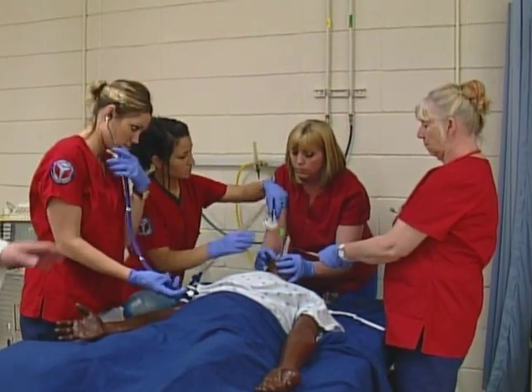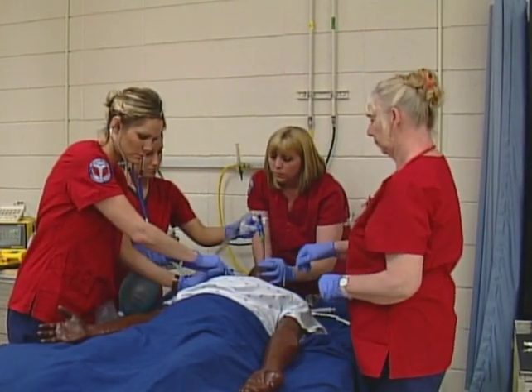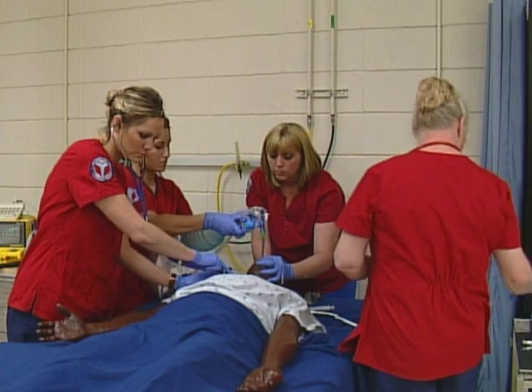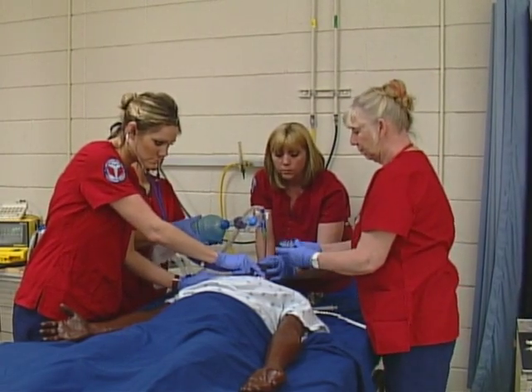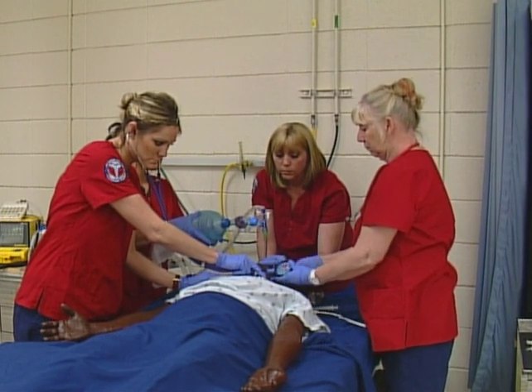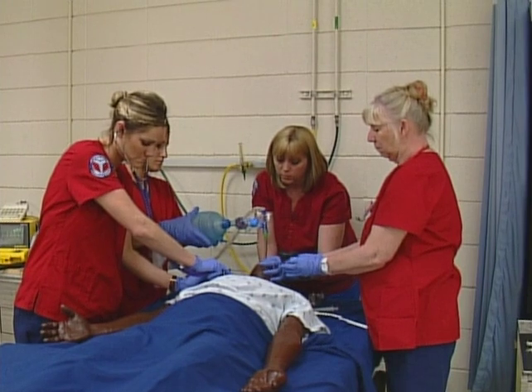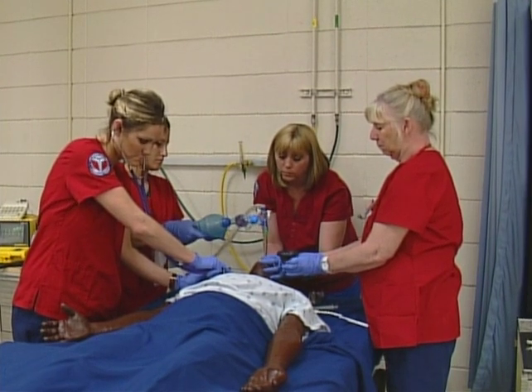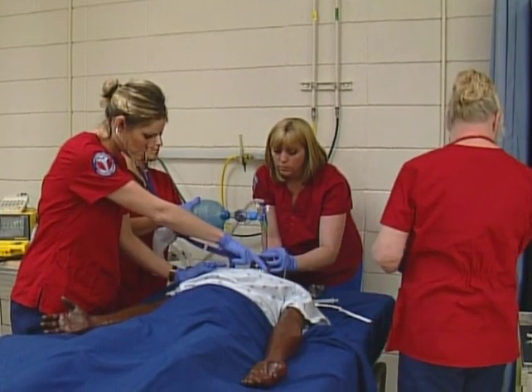Beverly inflates the cuff to make sure we seal the ET tube. At the same time, Carrie puts on an inline suction catheter, and now we are reventilating the patient. Beverly is checking the pressure on the cuff, making sure that we're not overinflating and damaging that tracheal tissue, but also making sure that we have pressure to prevent leakage.